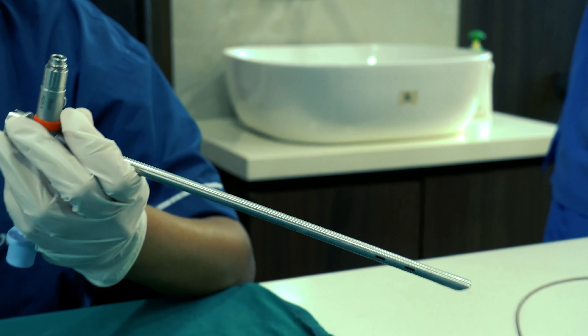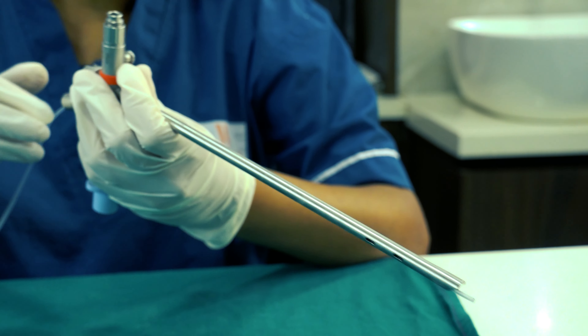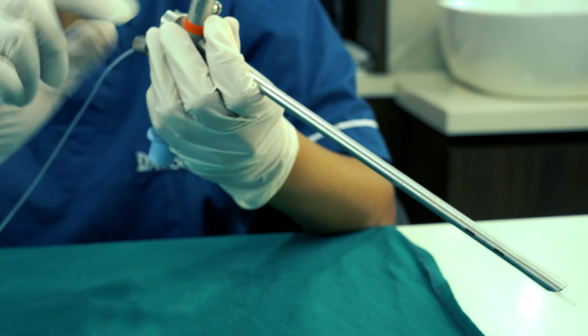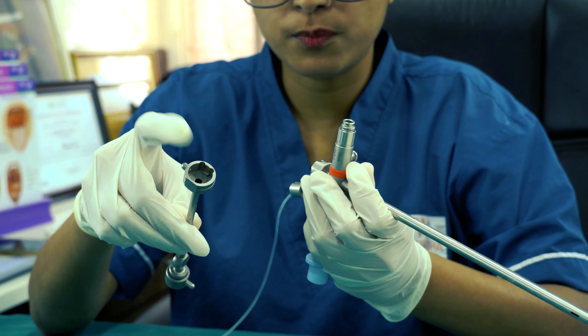Here we can introduce a feeding tube of size 6 easily. We can see it coming out through this end — the distal end — so we'll keep it somewhere here. Now we are going to introduce the telescopic rod lens through this port, the fourth port.